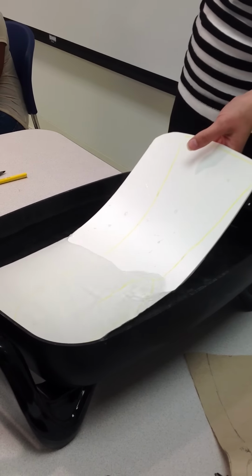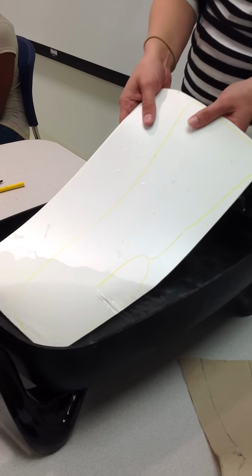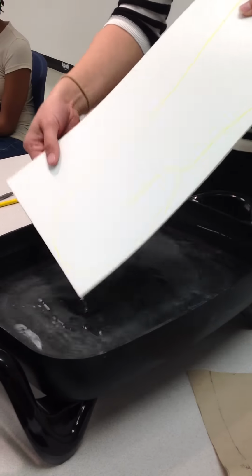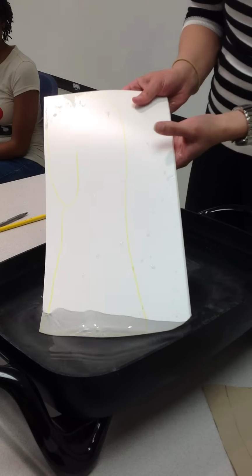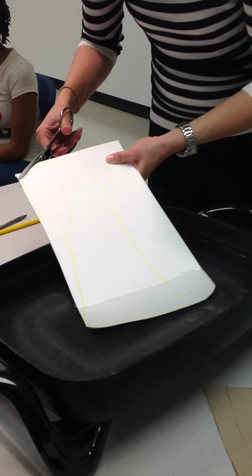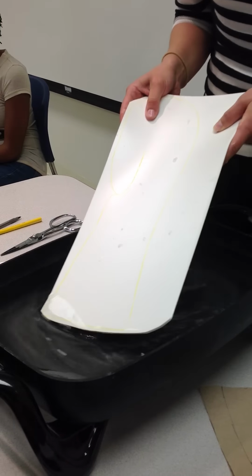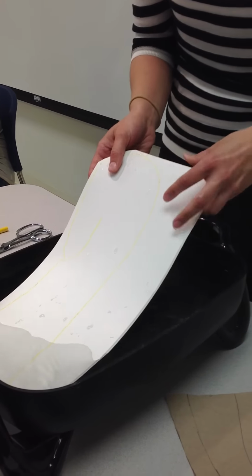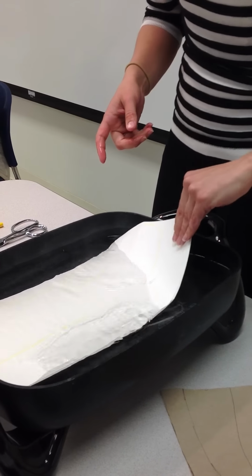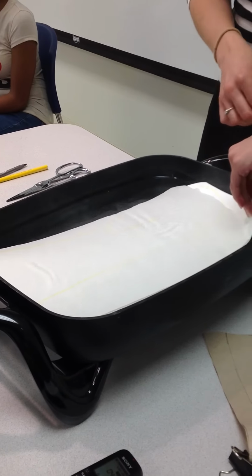So with this, you're going to have to push a little bit harder, this material, compared to the Aquaplast. And it has less drapeability, so it's not going to stretch out so much, which is what you're going to need with somebody, usually if they have any kind of tone. And this one's hard to work with if you have high drapeability, because with gravity it's going to pull it and stretch it out.